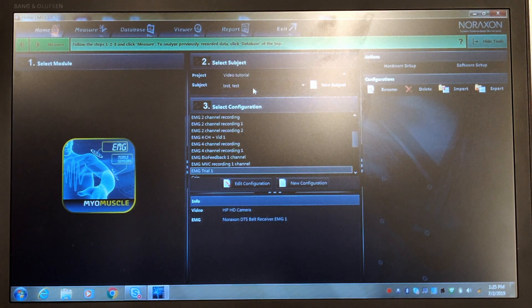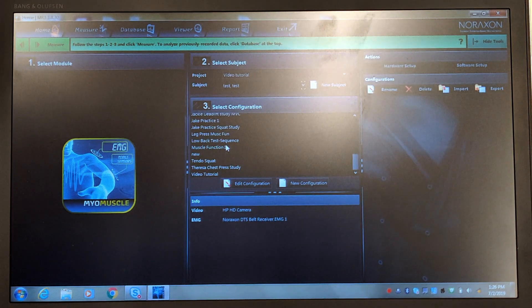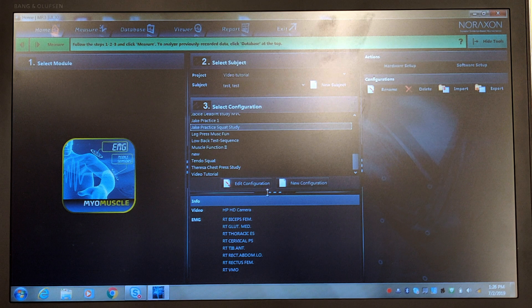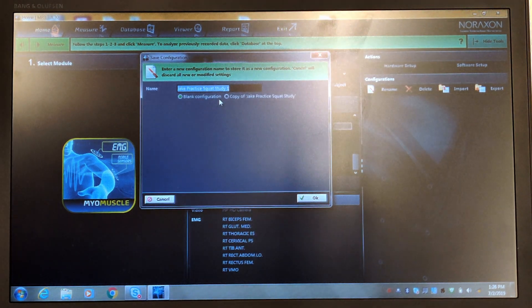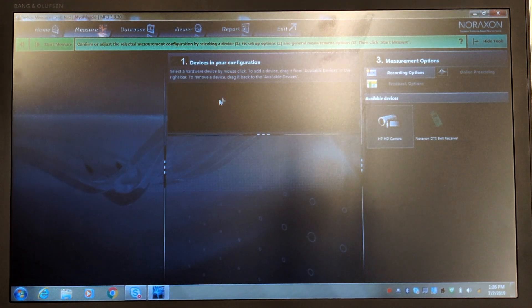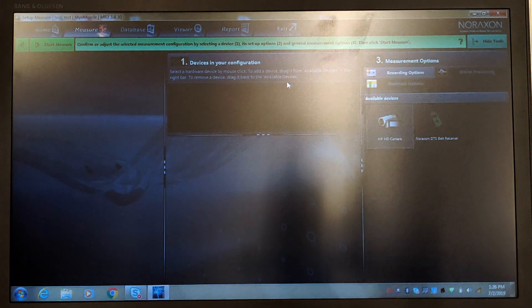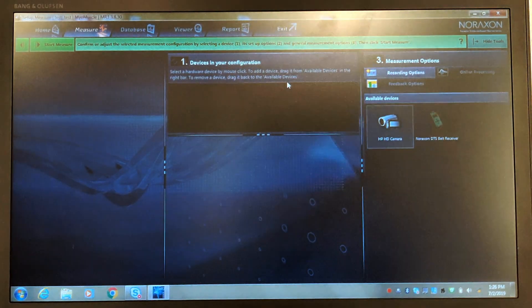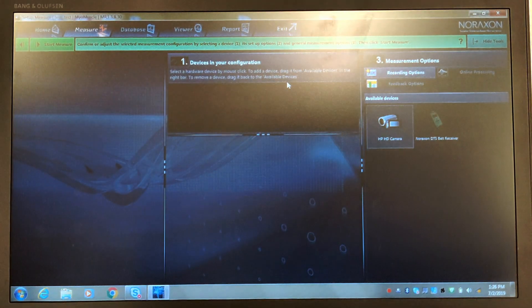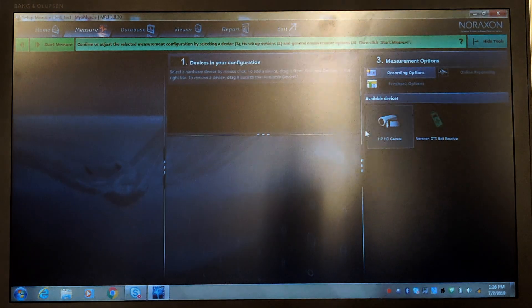Our subject is the only subject in this project and then we need to decide on a configuration. So we'll hit New Configuration and name it Video Tutorial Configuration. It's going to ask us what hardware we want to use — we're going to be using a camera that will allow us to denote different parts of the exercise the individual is going to be doing.